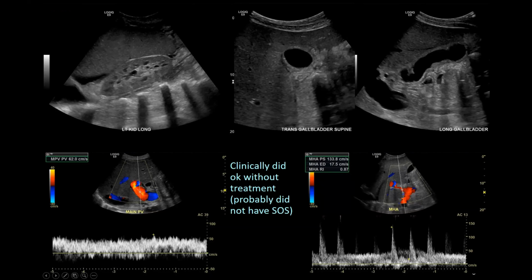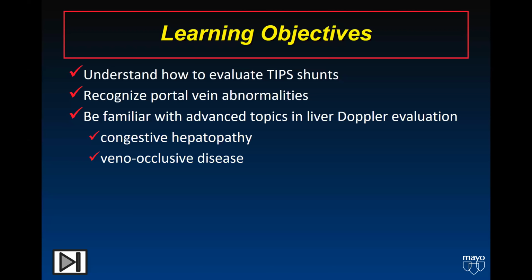So you're not going to be right all the time, but I want to make sure you know what you're looking for. So in conclusion, we've had a chance to do a variety of things, look at some tips, and make sure you understand some tricks.